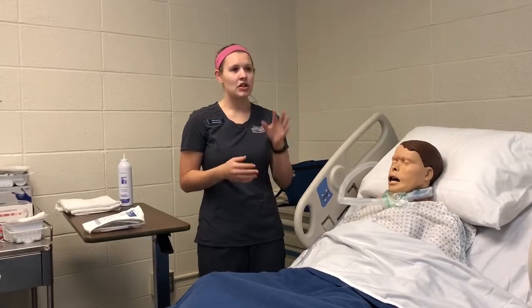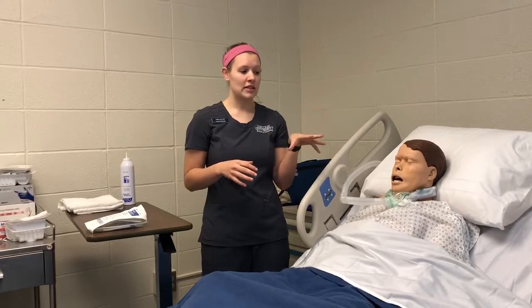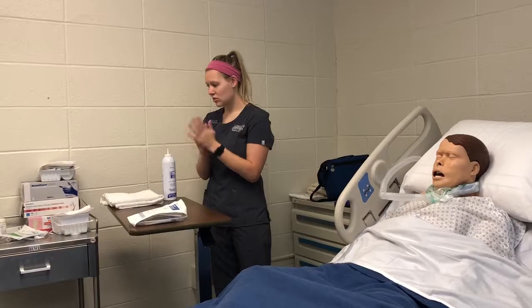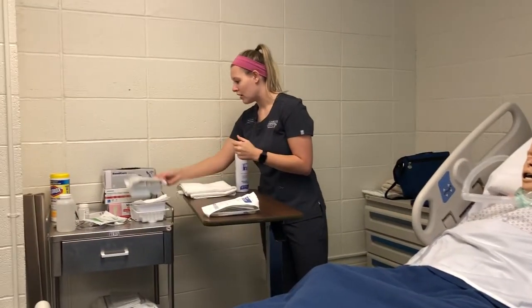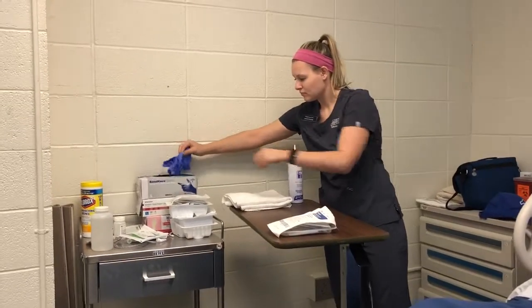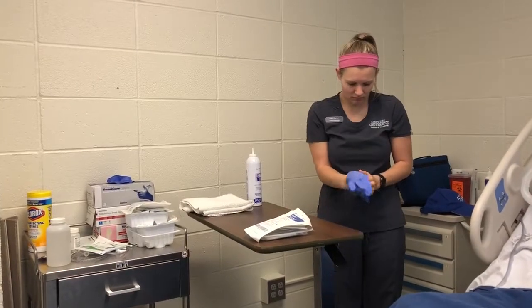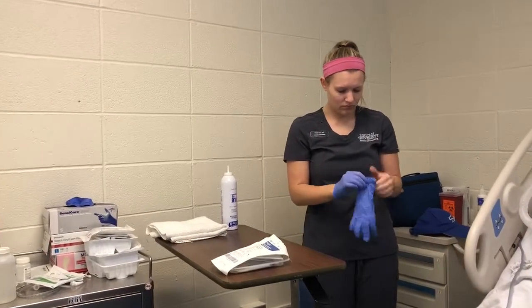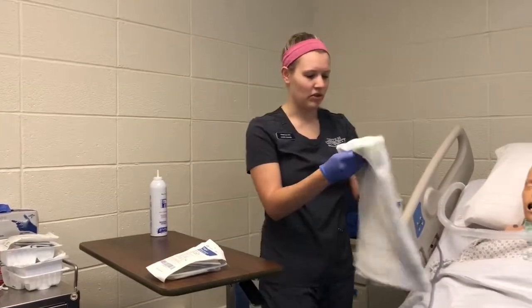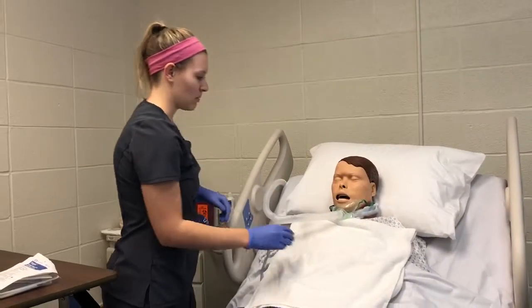So I've explained the procedure, I've provided privacy. The patient knows the reason that we're going to do this today. So I'm going to do some hand hygiene, and I'll put on a pair of clean gloves. Go ahead and put this towel over my patient, just so we don't make a mess. Sometimes trachs can be a little bit messy.